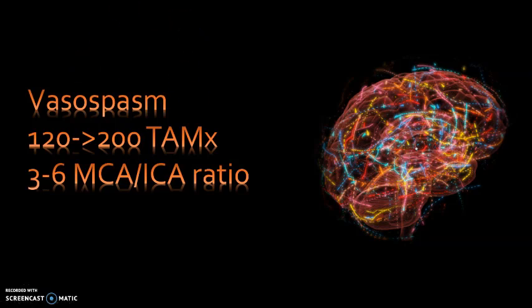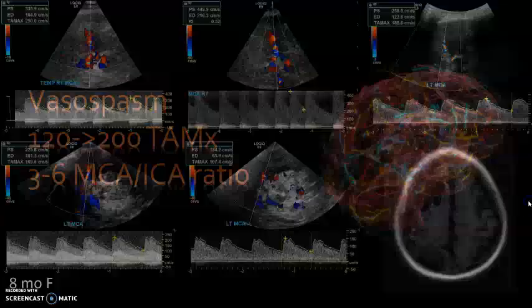A time average mean of 120 would be considered a mild vasospasm. Above 200 and 250 would be considered severe. We also get the peak systolic velocities of the MCA and ICA and divide them to get a ratio. Ratios from 3 to 6 are considered abnormal. Obviously, the higher the number, the more severe it is.